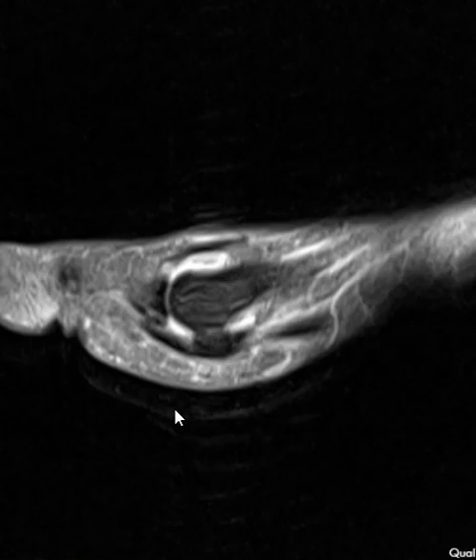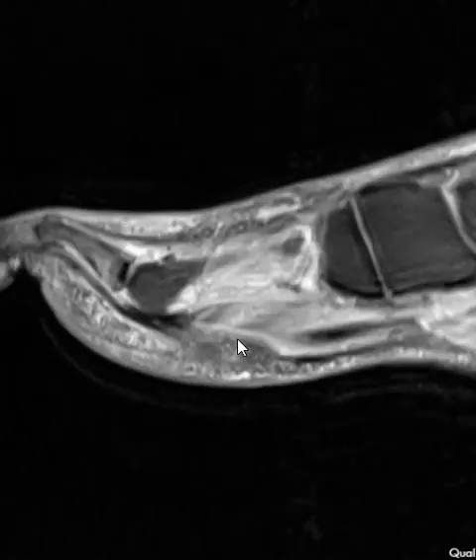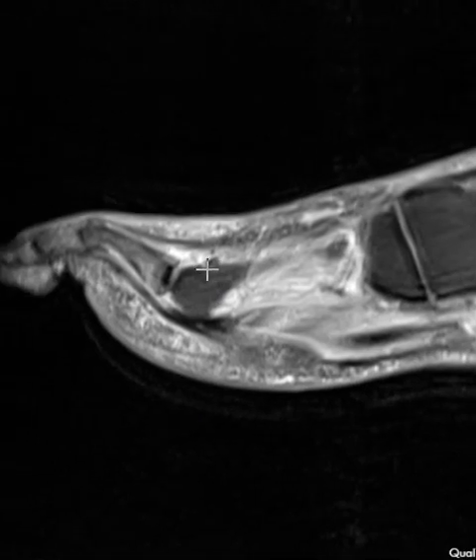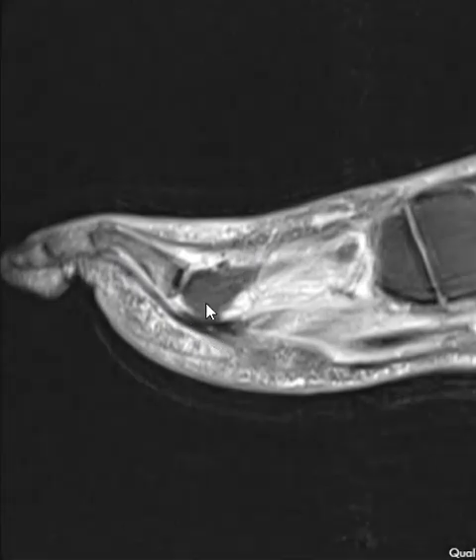On the sagittal view you can see all the motion artifact we're up against. They have an effusion of the first metatarsal phalangeal joint. Now going across to the second metatarsal phalangeal joint, we see the flexor tendon here, and deep to the flexor tendon we have the plantar plate. The plantar plate goes underneath and should attach to the base of the proximal phalanx of the toe. There's a little bit of brightness here — this is abnormal. So this confirms the plantar plate tear we saw in the coronal view.